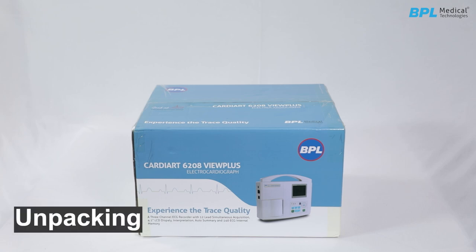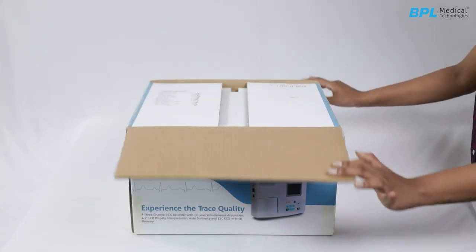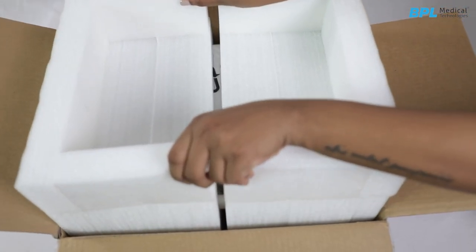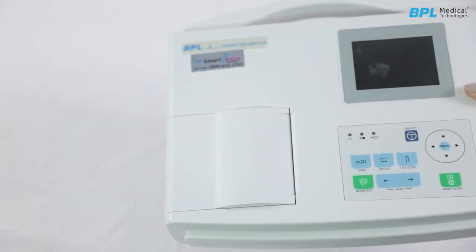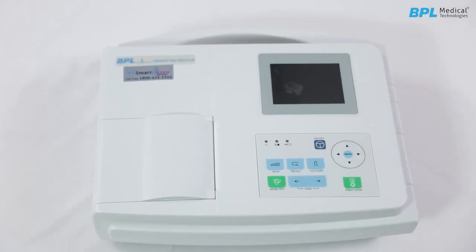Unpacking. Keep the carton box upright, remove the packing tape and open the flaps to access the accessories carton box. Carefully lift the unit out of the carton box using the integral handle. Remove the polythene cover and check for any damage. Please notify BPL or the service team if damage is evident.